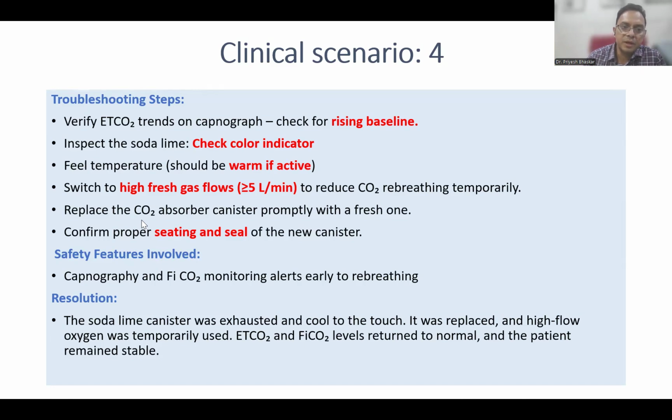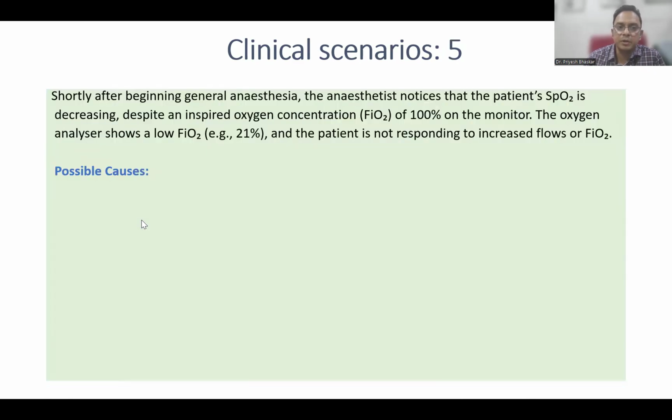The resolution was that the soda lime canister was exhausted and it was cool to touch. So it was replaced, and high flow oxygen was temporarily used. End-tidal CO2 and FiCO2 levels returned to normal and the patient remained stable.